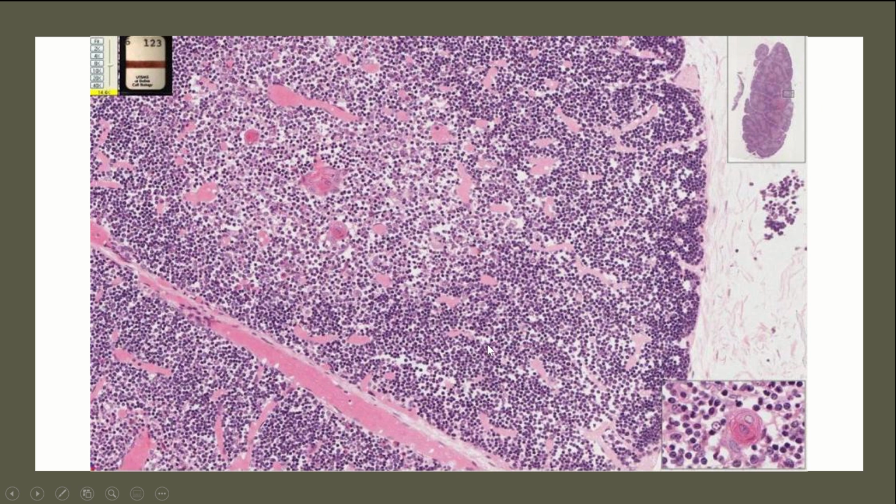But if we zoom in here a little bit, this is going to be that outer cortex region of one lobe. This lighter staining portion is going to be that inner medulla portion of one lobe. And you see these very light pink, thick blobs, those are those epithelial reticular cells, okay? And then right here is a Hassel's corpuscle. We'll look at it a little more zoomed in. There you can see a good zoom in of a Hassel's corpuscle.